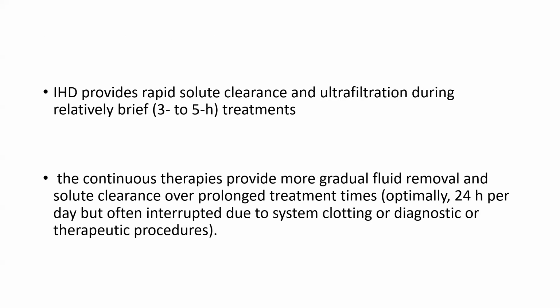IHD provides rapid solute clearance and ultrafiltration during a relatively brief treatment, that is 3 to 5 hours. The continuous therapies provide more gradual fluid removal and solute clearance over a prolonged period of time, optimally 24 hours a day, but often interrupted due to system clotting or diagnostic or therapeutic procedures.